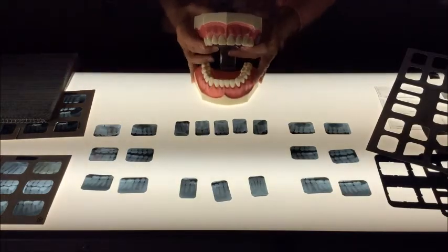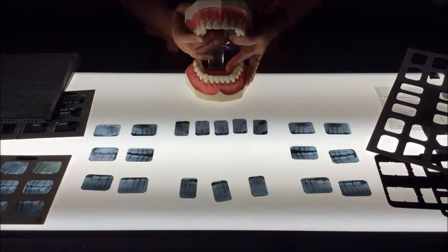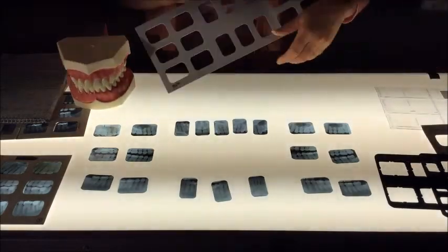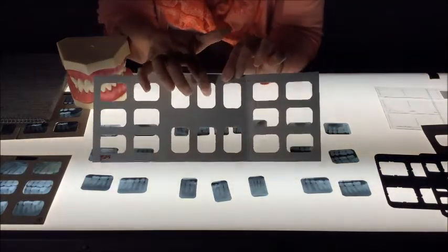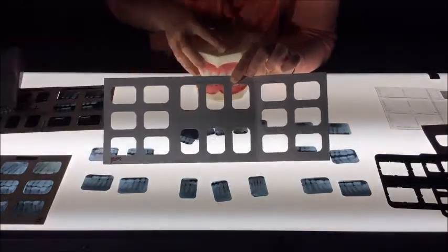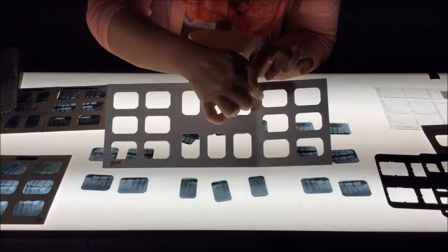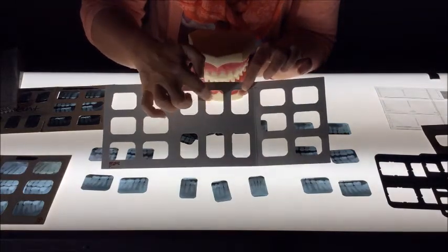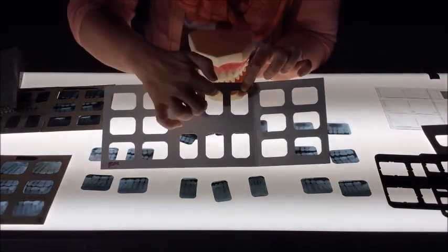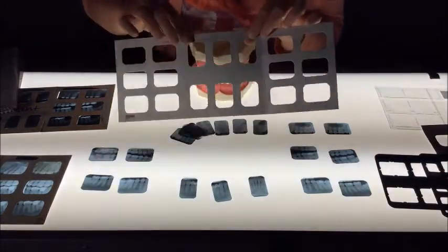The hard part of the anterior periapicals compared to mounting the other films is that now we have to orientate so that we get the central incisors in the middle frame or window on the mount. The teeth beside the central incisors are the laterals, and then you'd have the canines. Now, if I had 5 frames or windows up above here, I could easily do centrals, laterals, and canines on both sides. But we only have 3, so probably we're going to have centrals and some laterals here, then probably a lateral and canine here, and a lateral and canine here.